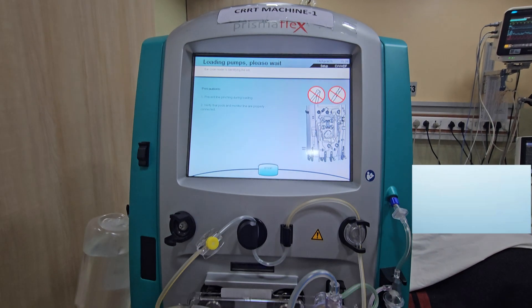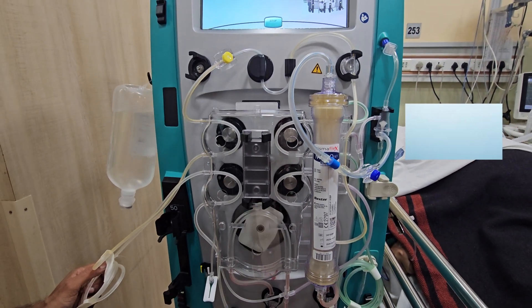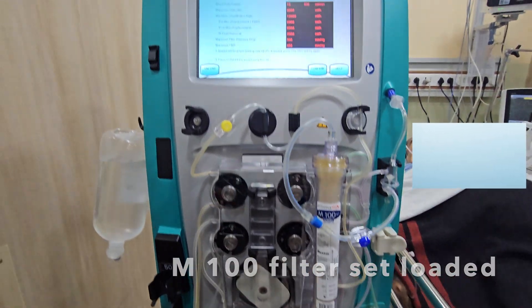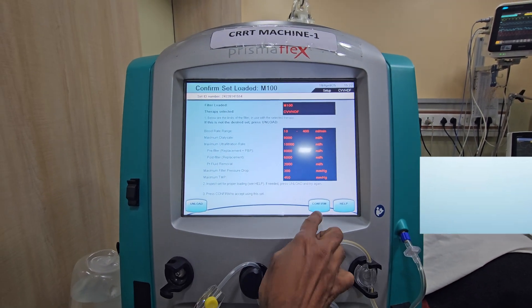Load is selected. The machine will load the filter set automatically. Confirm.